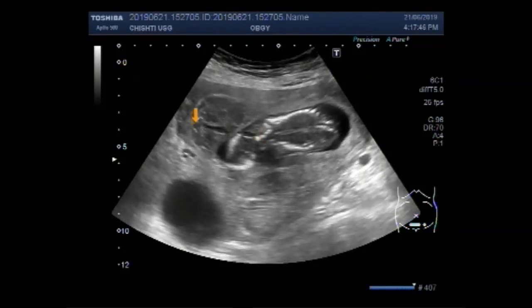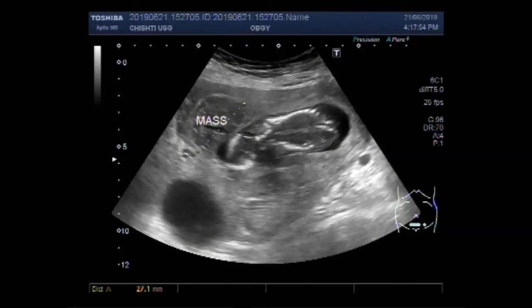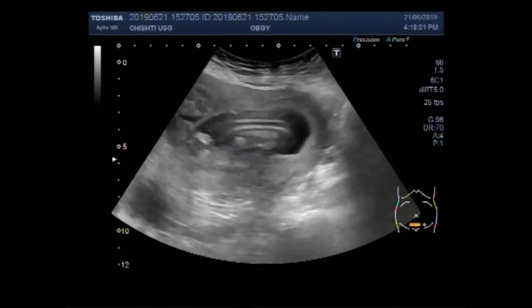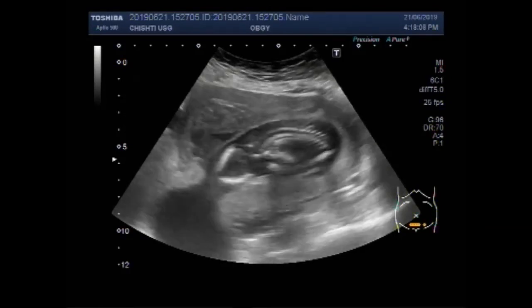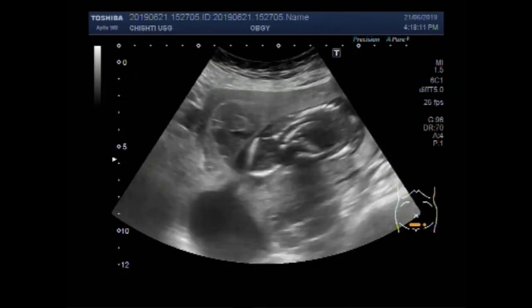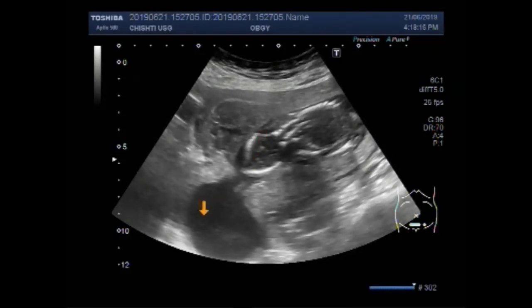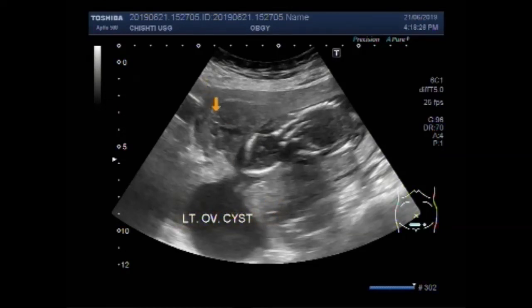Now you can see the mass in the anterior wall of the uterus, and the mass measures about 3.9 cm by 2.9 cm. You can see the fetus having no fetal cardiac activity, no blood flow, and there are no fetal movements. This is the left ovarian cyst, this is the mass in the anterior wall of the uterus, and this is the fetus.